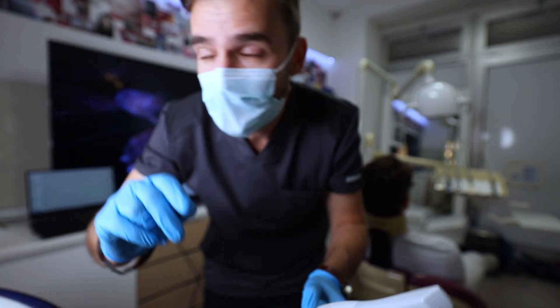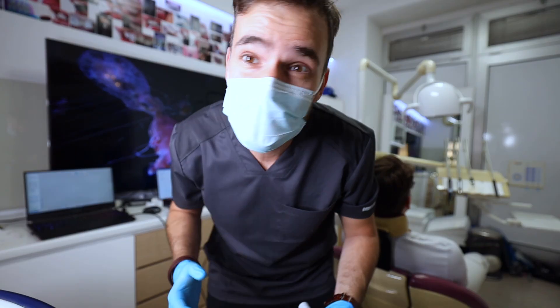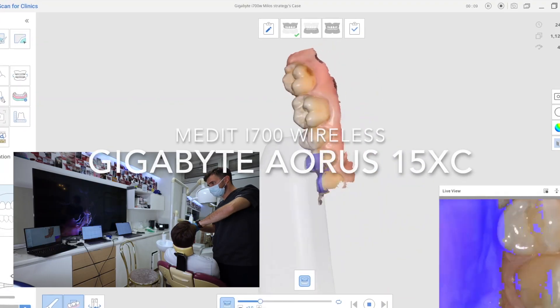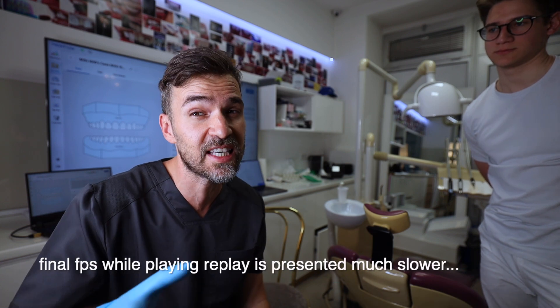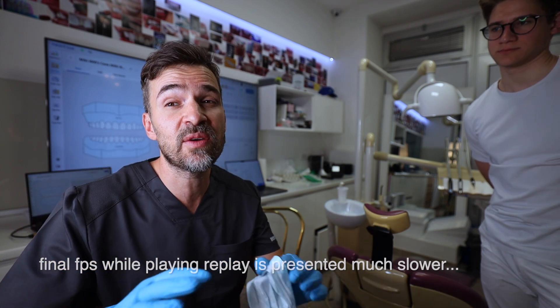i700 take 2 on the PC laptop, without any external monitors or screen recording, so we can see the true results. The frame rate for the i700 on the PC laptop was around 40 frames per second. Usually when working with patients it's about 60 to 65, sometimes even 70, but typically around 60 to 65.